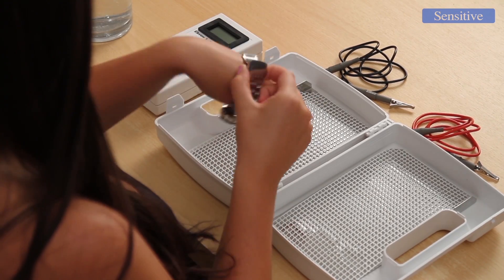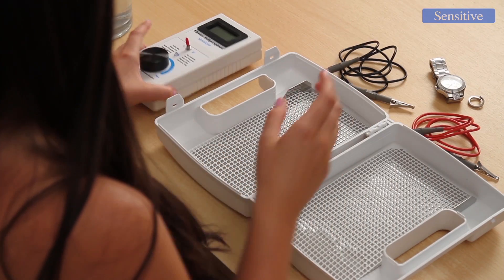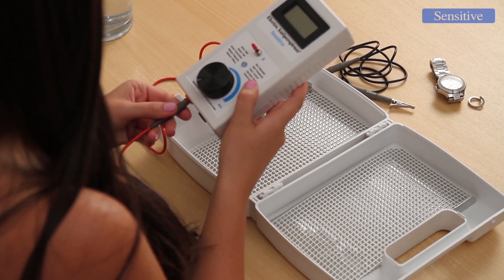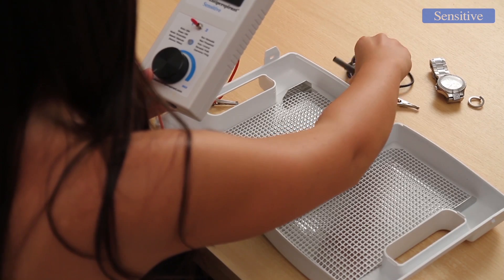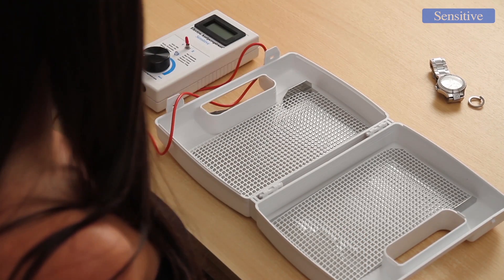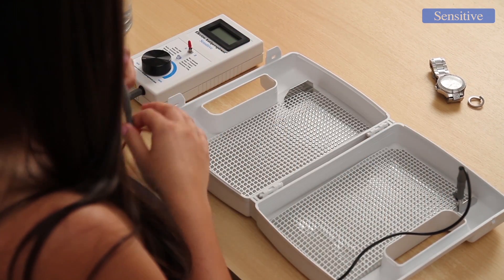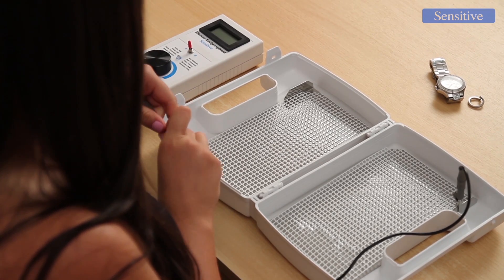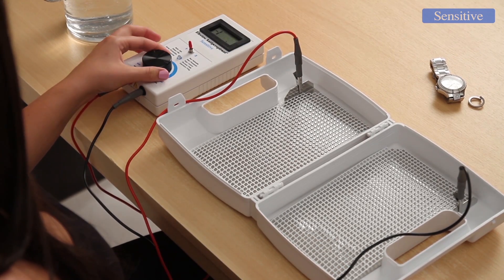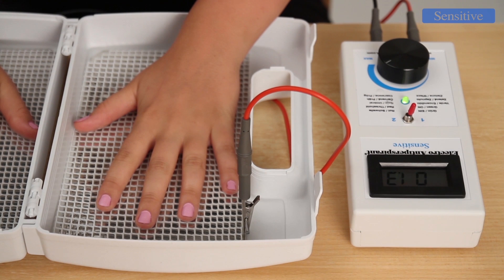Before performing therapy, please remove all metal objects from places that will be immersed in water. Then connect the supplied cords to the Electroantiperspirant Sensitive — red cord to the red terminal and black cord to the black one. Connect the second part of the cord to the electrodes immersed in water and switch the device on. Electroantiperspirant Sensitive features proprietary technology which allows treatment of both hands without the assistance of another person. Start therapy simply by selecting the required intensity and inserting hands or feet in the water container.